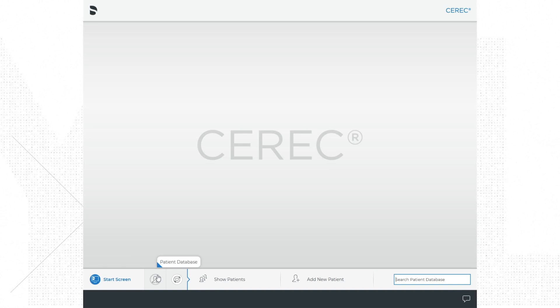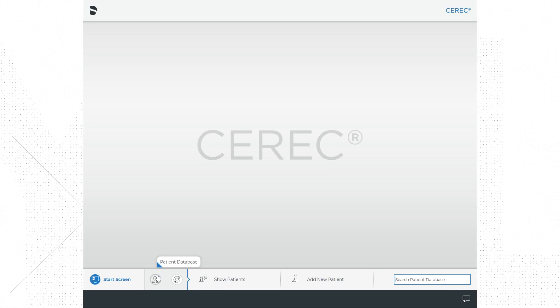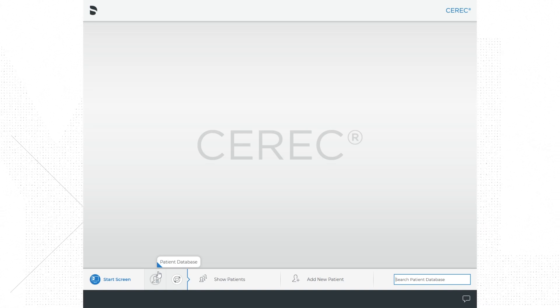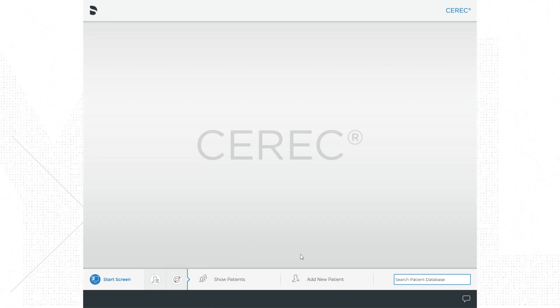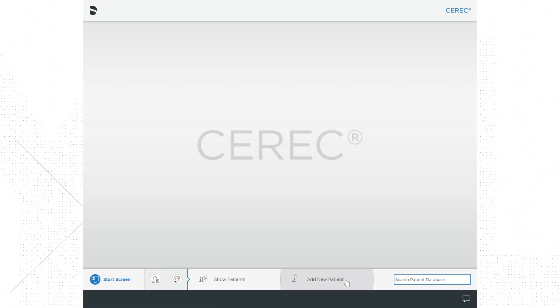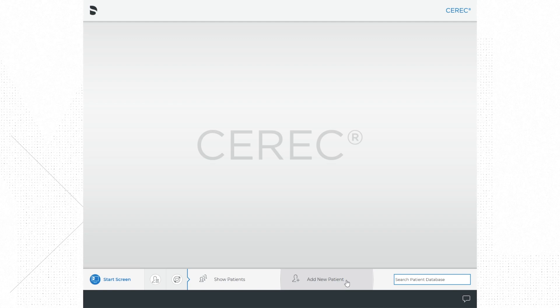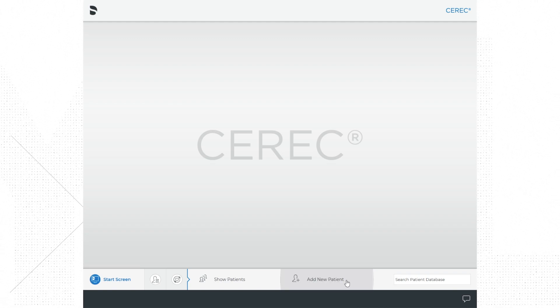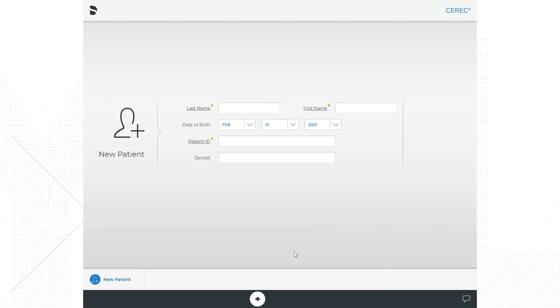For new patients on the start screen, you will select add new patient at the bottom of the screen. Go ahead and click on add new patient.